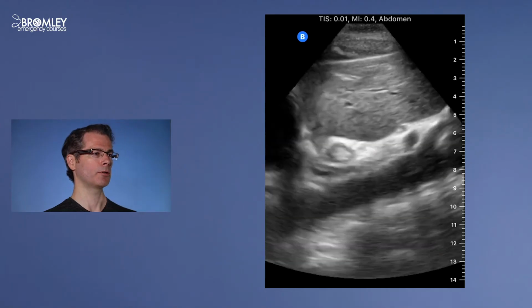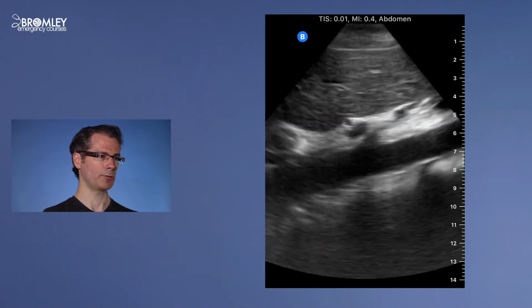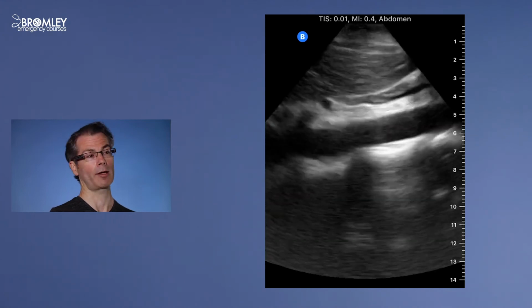Here is the same thing, but in long axis. So exactly the same thing. We start at the xiphisternum and we slide all the way down to the bifurcation, but this time in the long axis of the vessel.